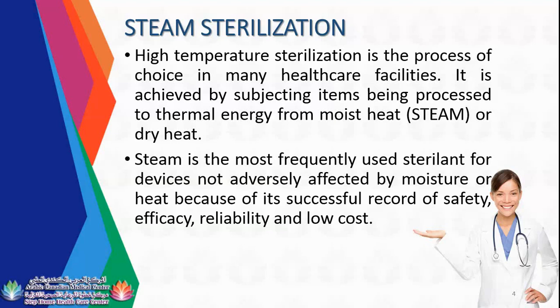It is achieved by subjecting items being processed to thermal energy from moist heat, which is steam, or dry heat. Steam is the most frequently used sterilant for devices not adversely affected by moisture or heat because of its successful record of safety, efficacy, reliability, and low cost.